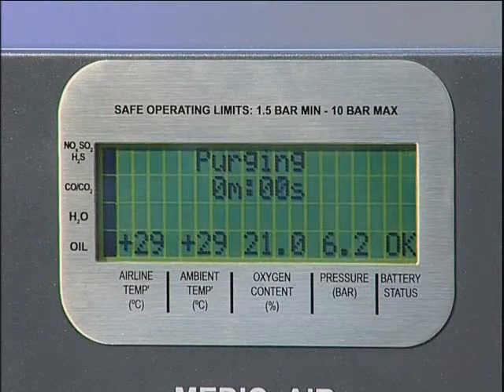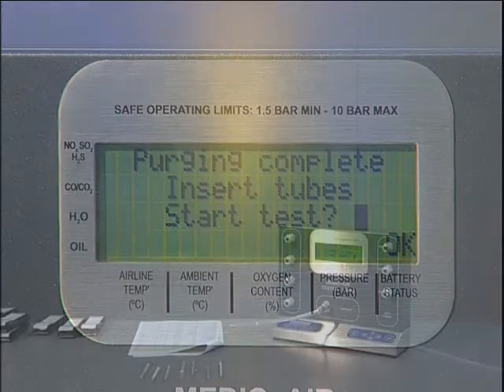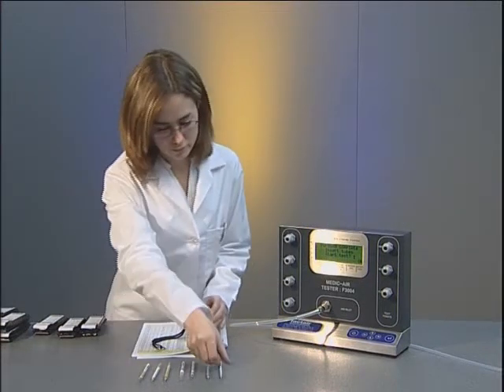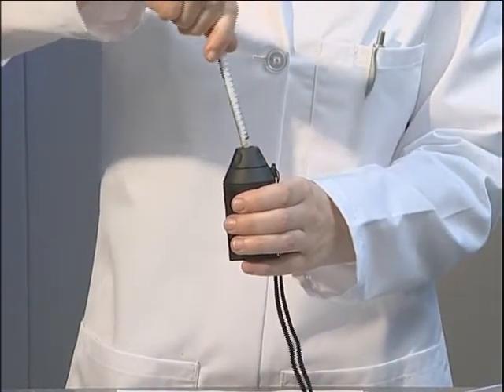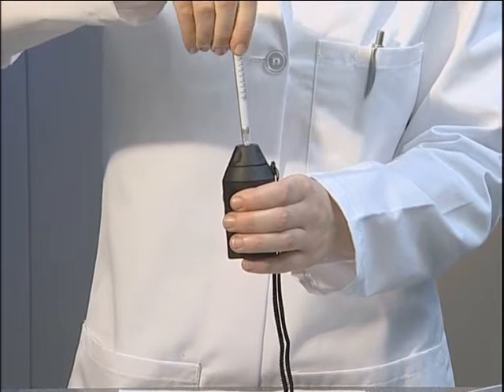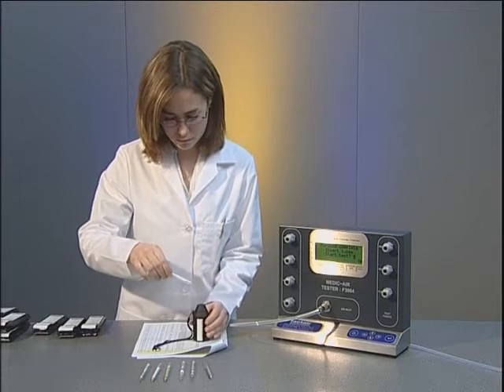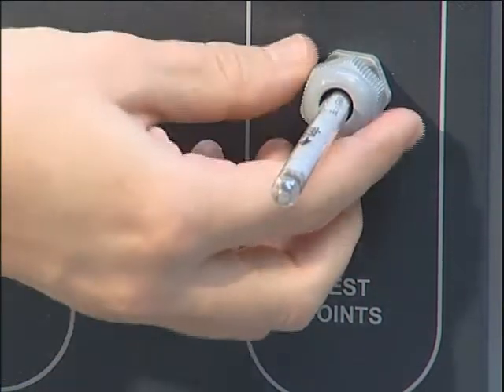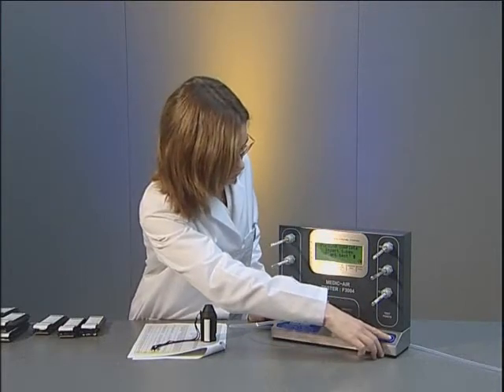Once the purge has finished, the Draeger tubes can be prepared for insertion. Remove both ends using the cutter provided. This ensures a clean cut is made and that glass fragments do not fall into the tube ports. The latest Draeger tube tip cutter has three cutting blades. Insert the tube into the hole and gently rotate, then rotate the tube to the side to break the tip. The tube tip will be retained within the cutter for later disposal. As each tube is prepared, it should be inserted into the relevant gland with the arrow pointing outwards and tightened firmly. Once all seven tubes have been inserted, press ENTER to start the test.